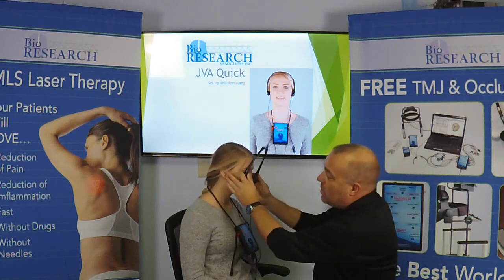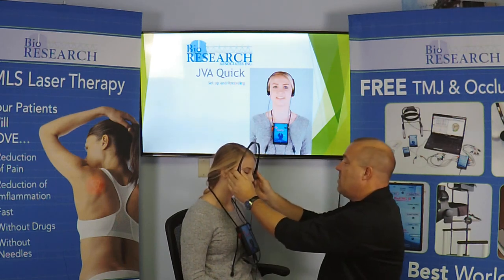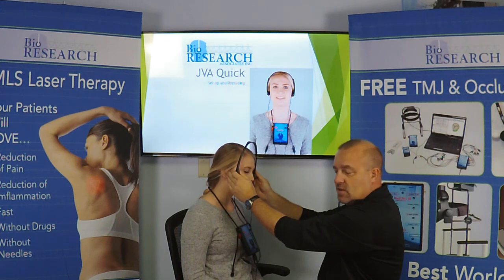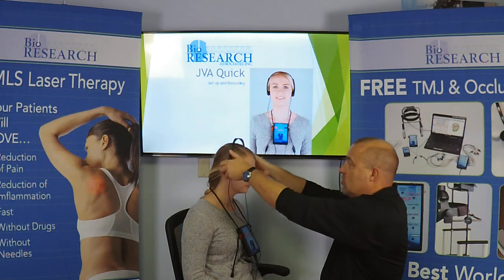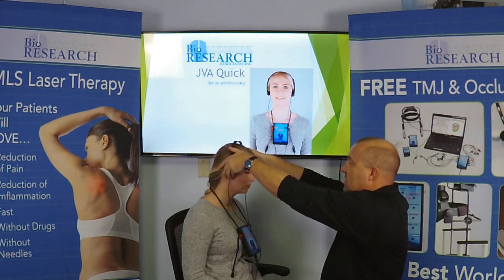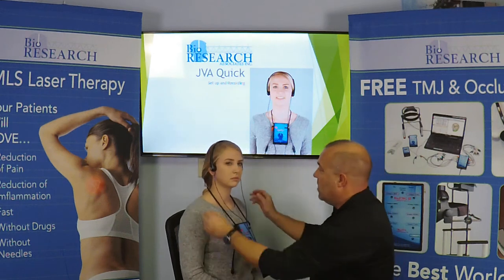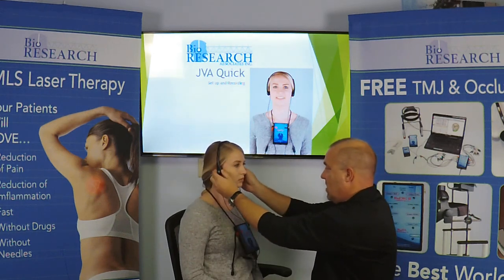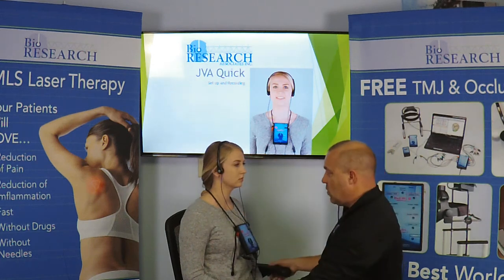All we're going to do is palpate right in front of the tragus, this little bump in their ear. We're going to palpate right in front of that, have the patient open, and I can feel the joint moving. And we just want to place the sensors right over the temporomandibular joint, and then with our thumbs, bring the headband down so it's nice and secure. We want to look at the patient straight on and make sure that we aren't real imbalanced with the way the headset is on the patient's head, okay? And we're ready to take our recordings.